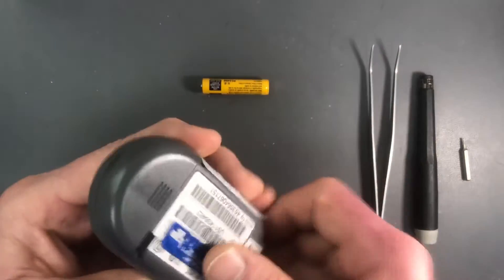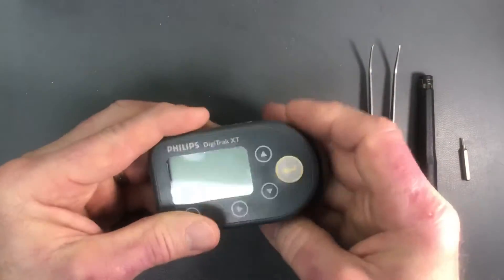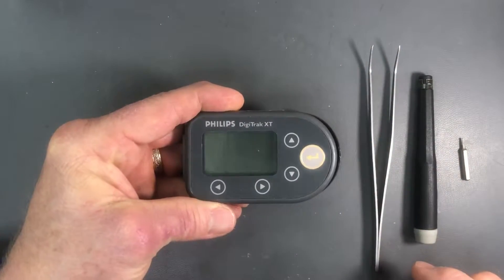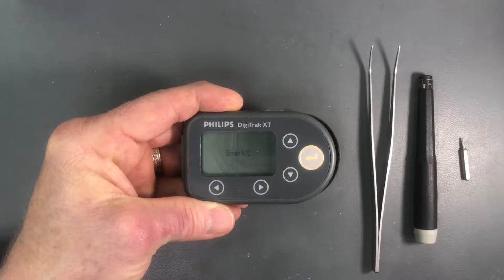To demonstrate what that looks like, we will put a battery in here and wait for the device to come up. You can see there's an error 602 displayed there.